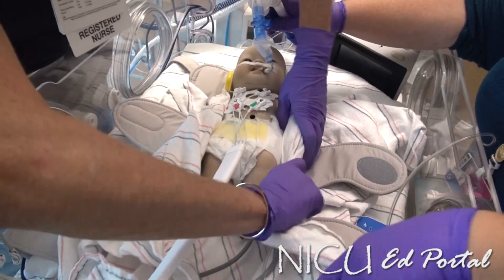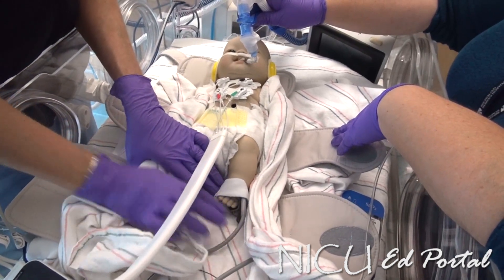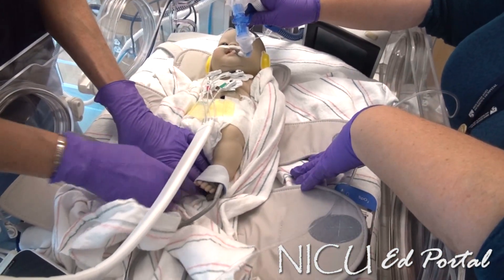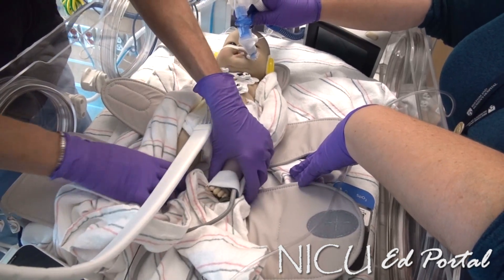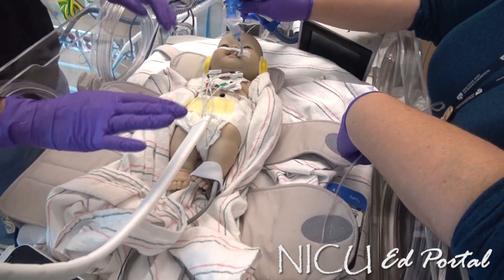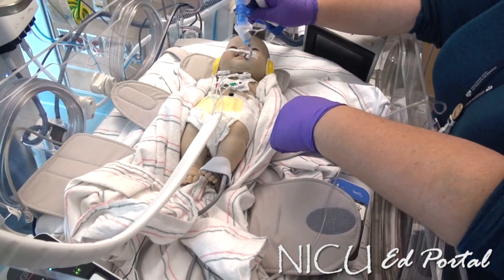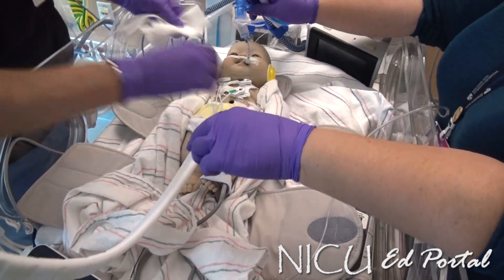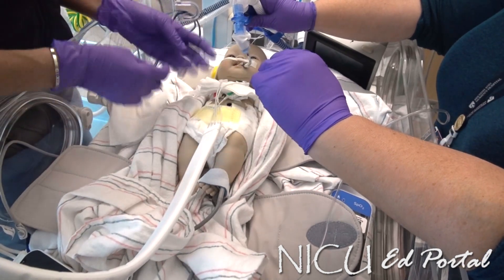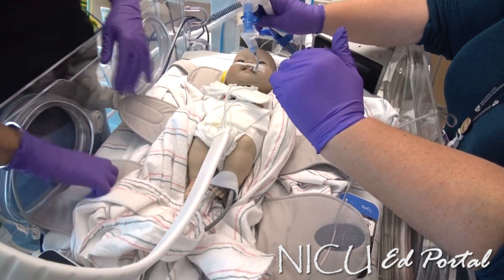Wrapping up this arm and keeping it in place. We also need to make sure his legs are straight down — you can see the O2 monitor there. I like to leave it accessible because if the babies kick too much we can lose pick-up, and it's important to maintain that while he's in the machine. Most importantly, these leads can actually burn the baby if they touch the skin, so we put gauze protectors underneath each one of them. No change here — this is the way we've always done it.